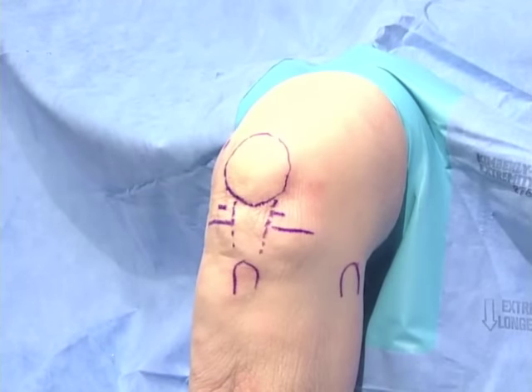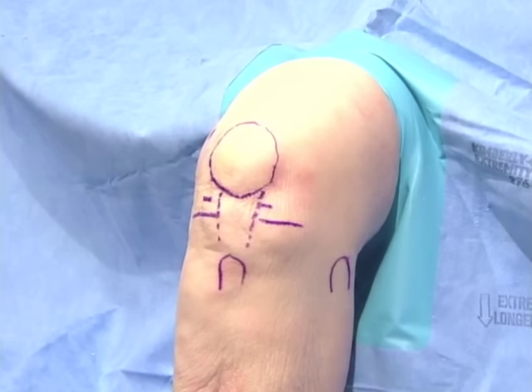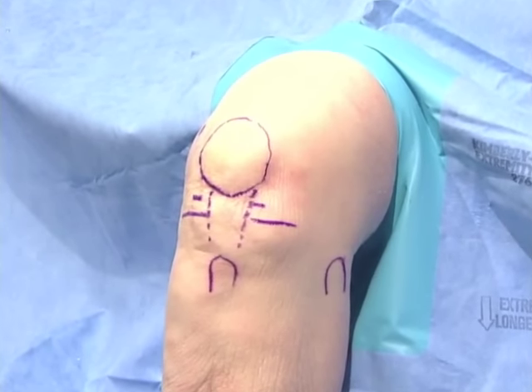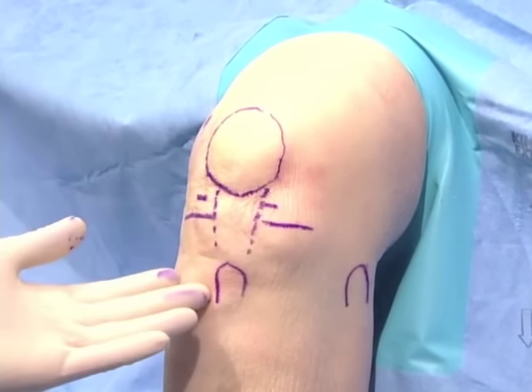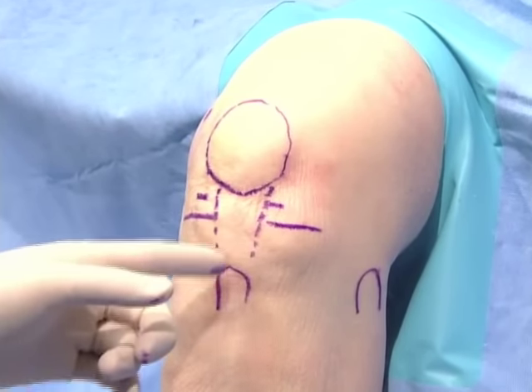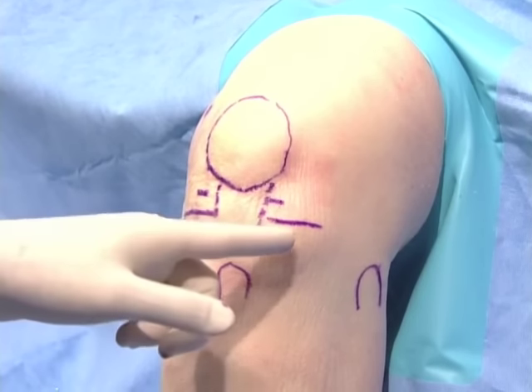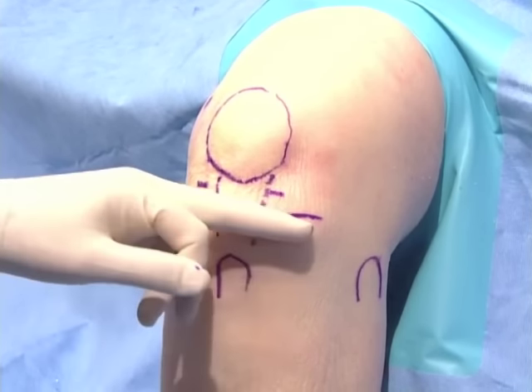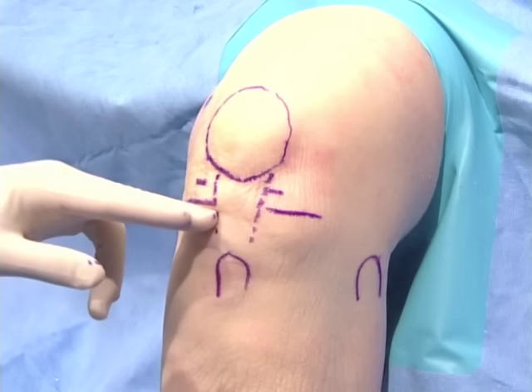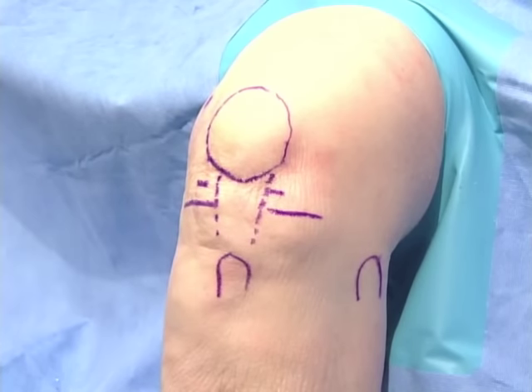Today we're working on a left knee. We're going to review the surface anatomy. We have marked the kneecap, the tibial tubercle in dotted lines, the patella tendon, the medial and lateral tibial joint line. Typically the lateral joint line is a little higher than the medial, the head of the fibula, and finally our three arthroscopic portals.